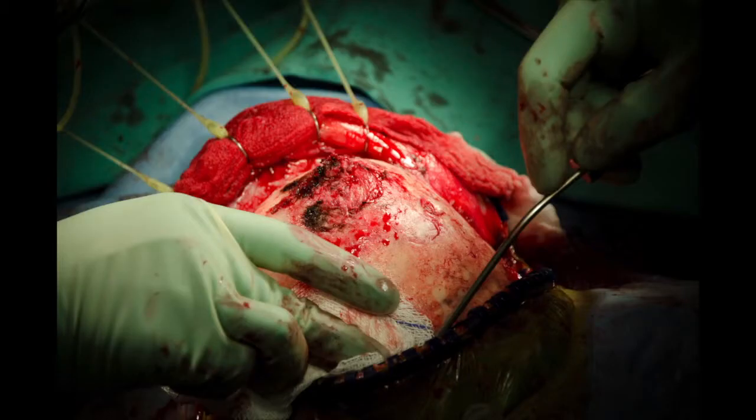At this point, the scalp is retracted forward to expose the frontal skull. Perforating towel clamps and rubber bands attached to a Leyla bar apply tension and maintain exposure. The surgeon must always be cognizant of external pressure on the orbits and should take measures to minimize potential complications by lowering the Leyla bar and removing unnecessary drapes in that region.